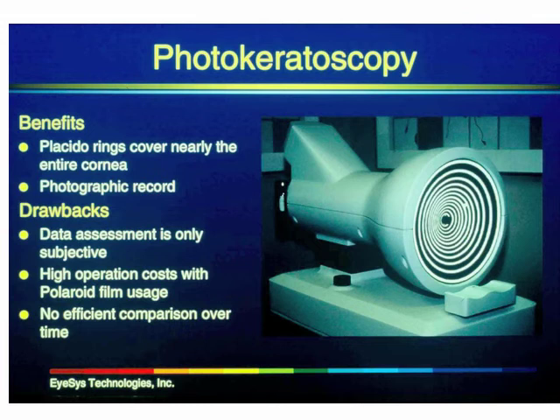And someone had the bright idea of mounting a Polaroid camera, an actual Polaroid camera, on the back of a Placido disc. And this is what a photokeratoscope is. When I was a fellow at Mass Eye, there were charts with Polaroid pictures of Placido disc images stapled into the patient's charts. And you say, well, Josh, I didn't know in your days they even had staples. No, but it's true. We had staples and real paper and Polaroid pictures stapled to the charts.